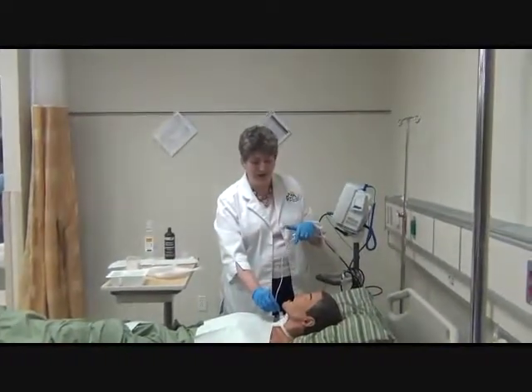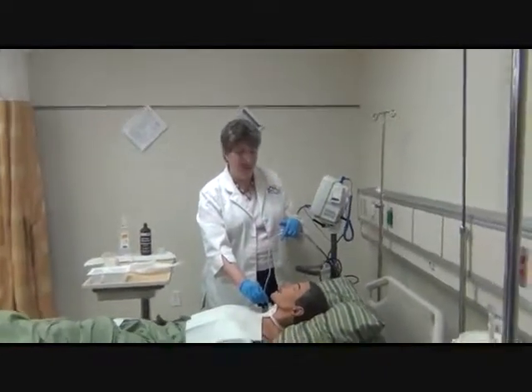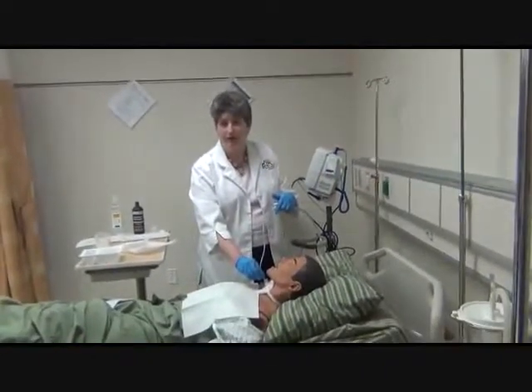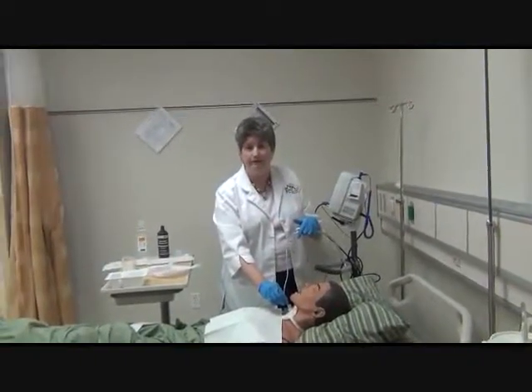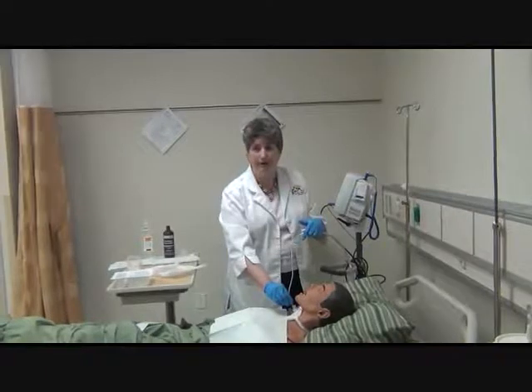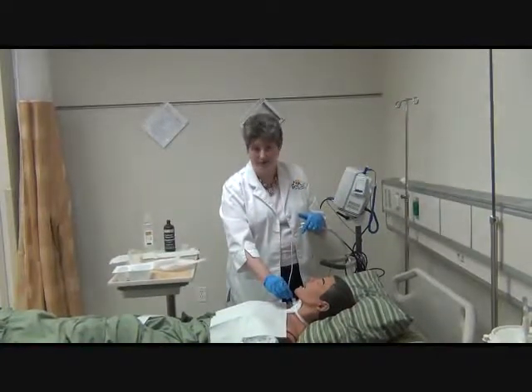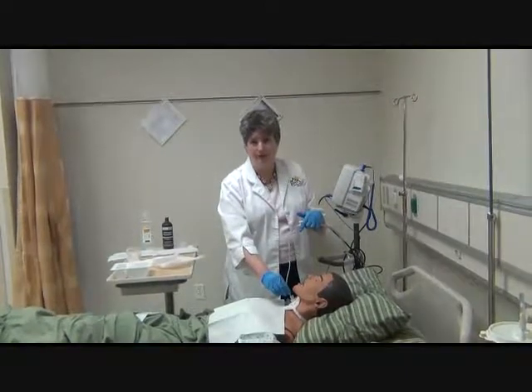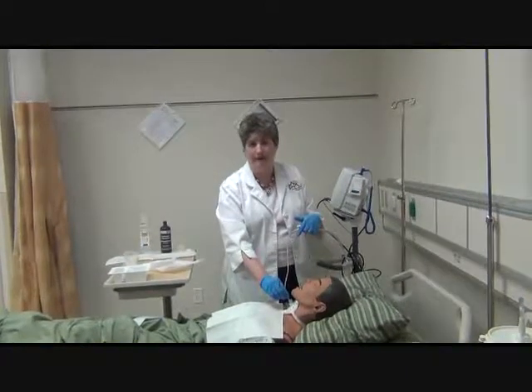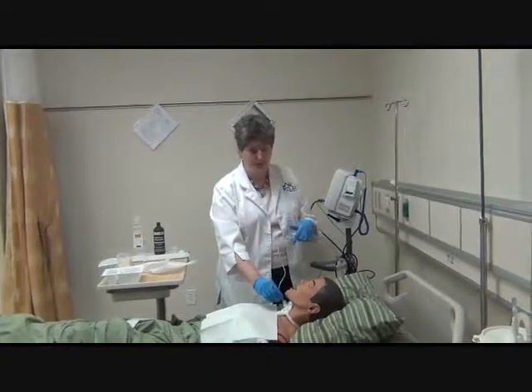So at the point that I'm ready to come out of the patient, I was taught to hold your own breath. If you think it's time, don't have a regular breath. If you take a regular breath and you feel like it's time for you to take a breath, it's definitely time for your patient to take a breath also. This makes them feel like they're getting winded or they've had their air sucked out of them. So it can be very uncomfortable, so be aware of that.